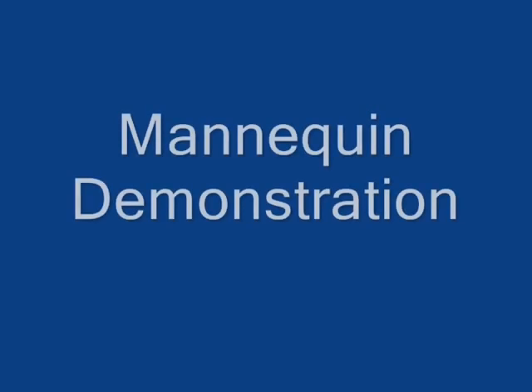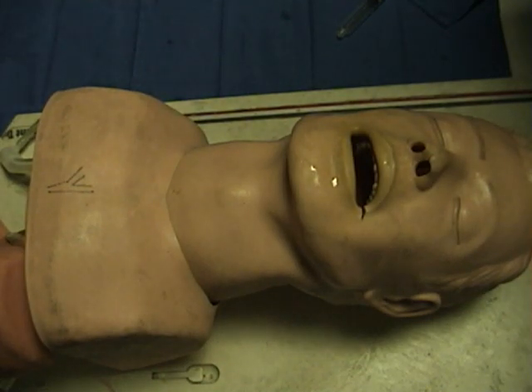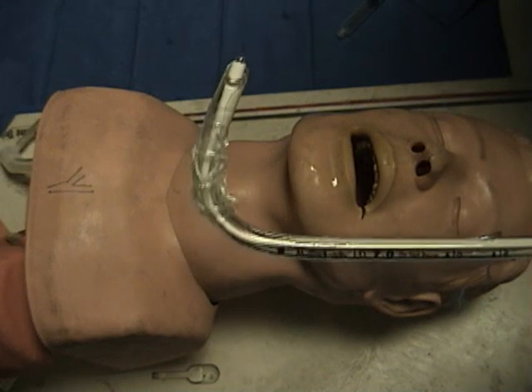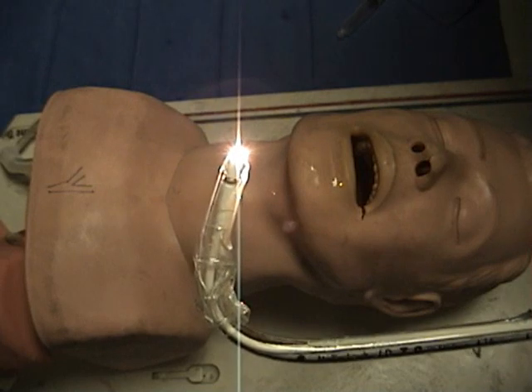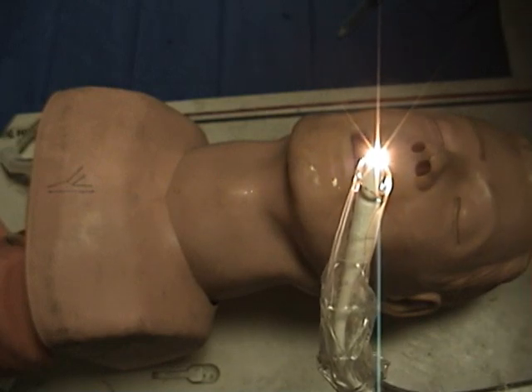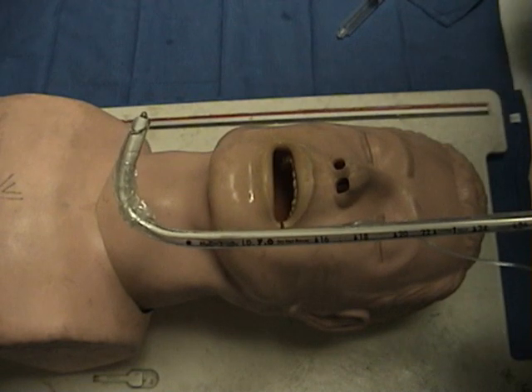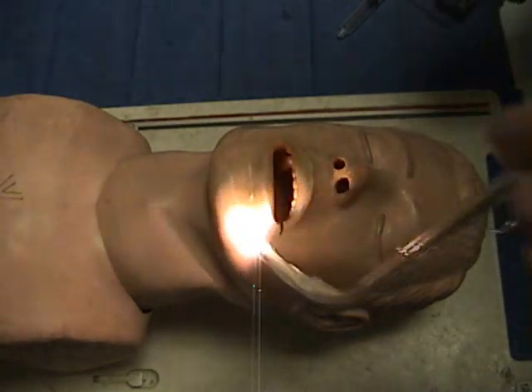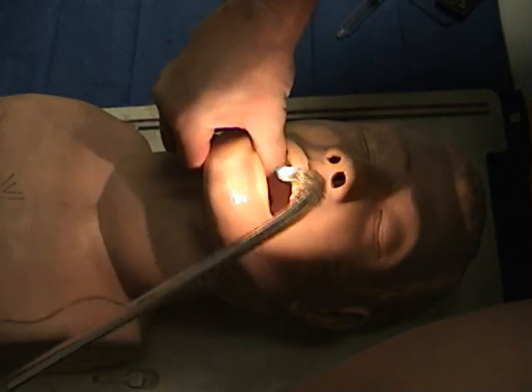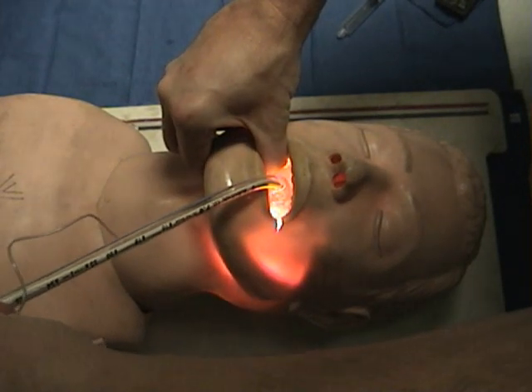Once we are set up, we are going to do some mannequin demonstration of the technique. A couple of things of importance: make sure we stay at the head of the bed, although from the side it can be done. We should test our stylet to make sure the light works appropriately, dim the light of the room, and use a non-dominant hand preferably to pull the jaw up. We introduce the thumb into the patient's mouth and by holding the jaw we lift it, which allows the epiglottis to detach from the back of the oropharynx. Once we introduce the wand, we can see how easy it is to transilluminate to the cheek.